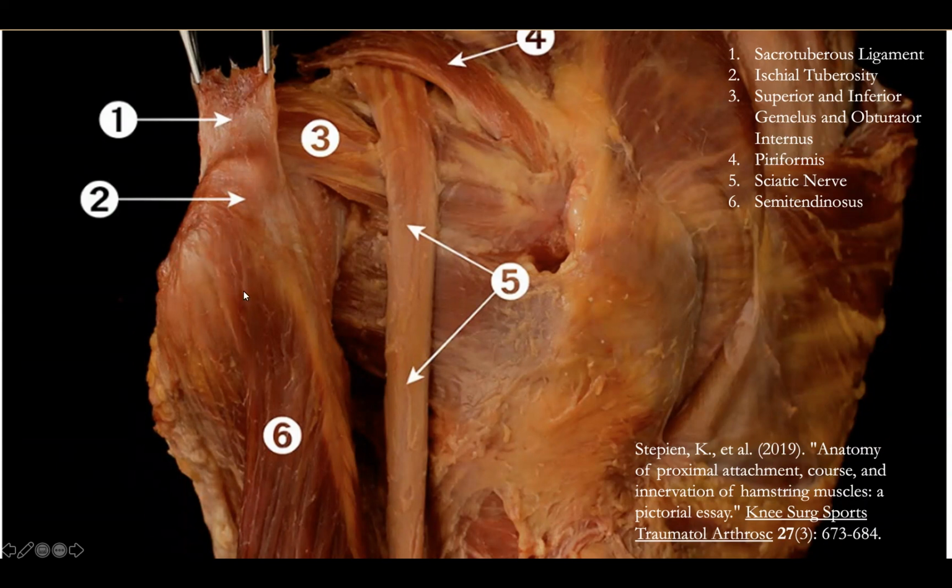So here you see the muscle of the semitendinosus. It arises somewhat directly off the back of the ischium, along with the conjoint tendon. And then this is the conjoint tendon here. Again, that is the origin for the semitendinosus and long head of the biceps femoris muscle. If you look closely here off the conjoint tendon, you'll see the long head of the biceps femoris muscle arising from a superficial and lateral position relative to the conjoint tendon.